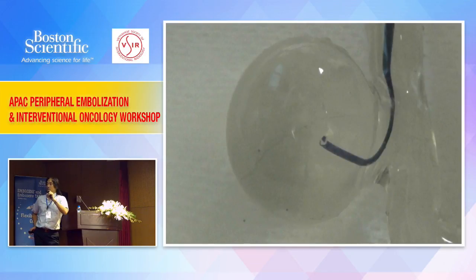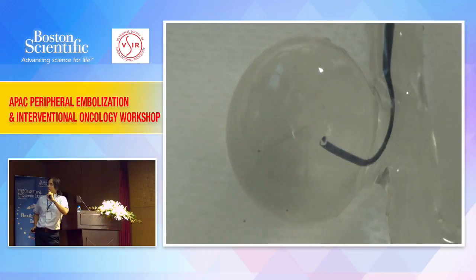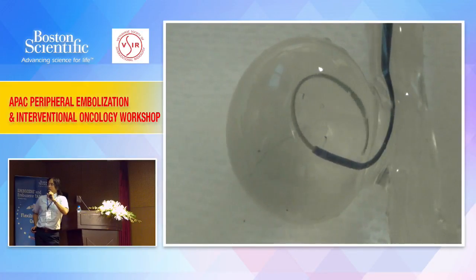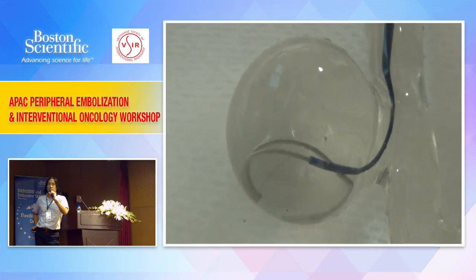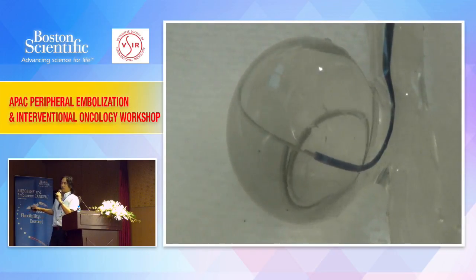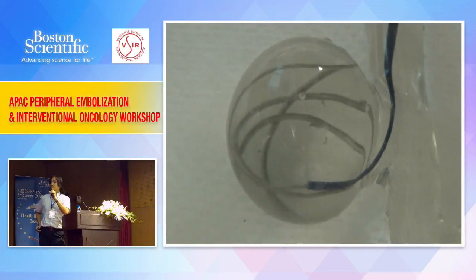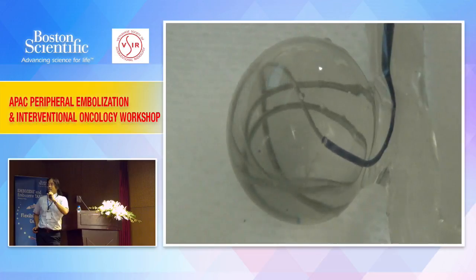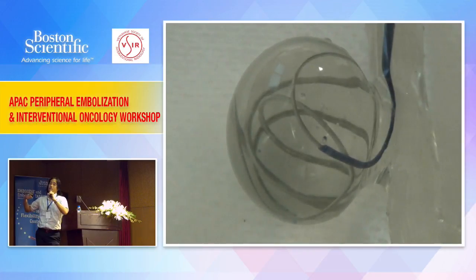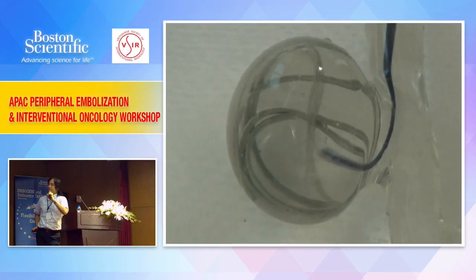This is a movie of a 3D coil using an aneurysm model. The 3D shaped coil is made for the embolization of aneurysms. So it moves and makes a good frame inside the aneurysm. It's totally different from the 2D shaped coil. This is framing.